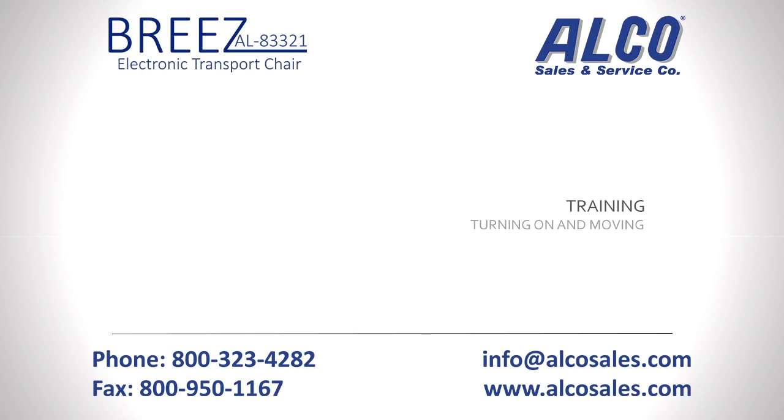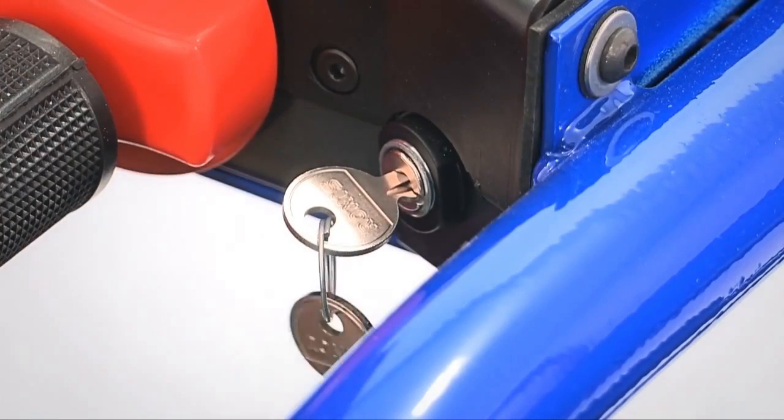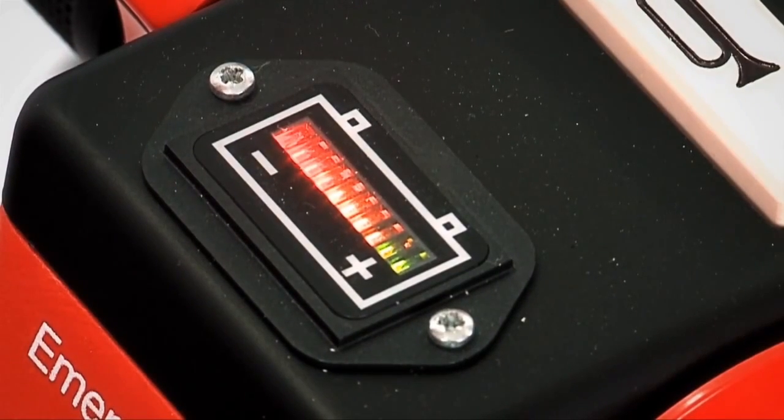Lower or reattach the armrest and adjust the leg rest so your patient is comfortable. Once your patient is safely loaded and comfortable, it is now safe to turn on the Breeze. Turn the key switch to the on position by turning it forward. The battery indicator will now come on and indicate that the Breeze is ready for use. If lights are flashing or only the red lights are on, stop and consult the owner's manual for further instructions.